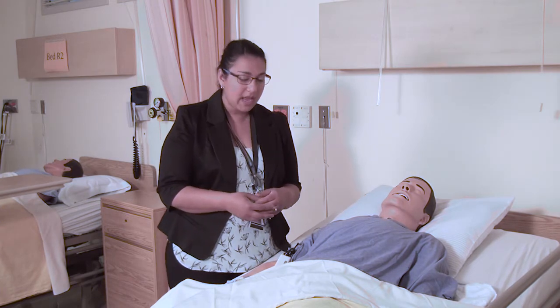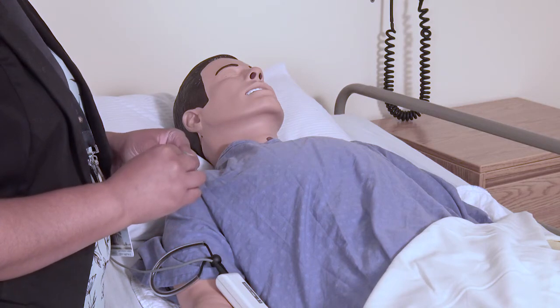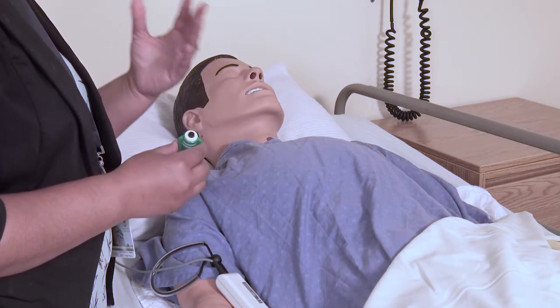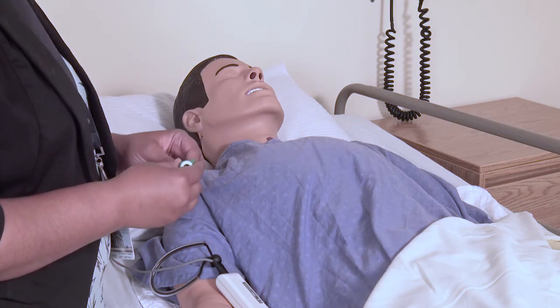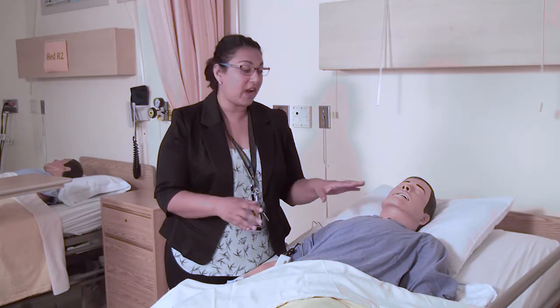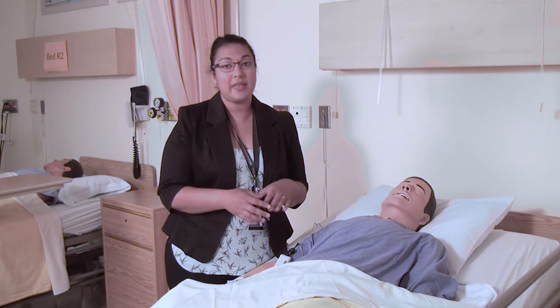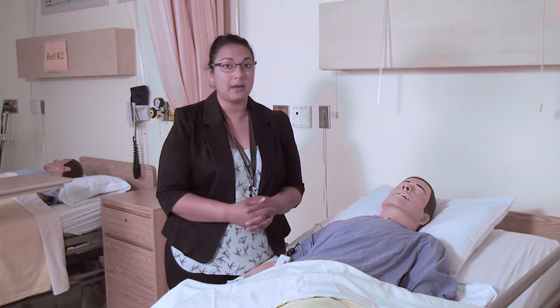And it's also important to know that you can press these buttons as much as you want. That's going to increase your demand, but the actual goods delivered, it depends on the lockout that the machine has been programmed for, that the doctor orders. So that's a really important key aspect to notify the patients with, because sometimes they think that they can keep pressing it and they're getting multiple doses of medication. And that's an education thing that you need to tell them about and really make sure that they understand that.